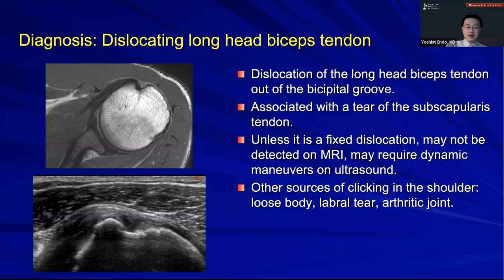I haven't mentioned this earlier, but whenever patients present with any sort of clicking or snapping, before we start scanning with the ultrasound probe, I always like to examine the patient and talk to them briefly, and make sure the patient can reproduce the clicking during the visit. If it only happens intermittently and they can't reproduce it during the visit, then there's no point in scanning the patient. I palpate the area and have the patient reproduce the symptoms before I start scanning.